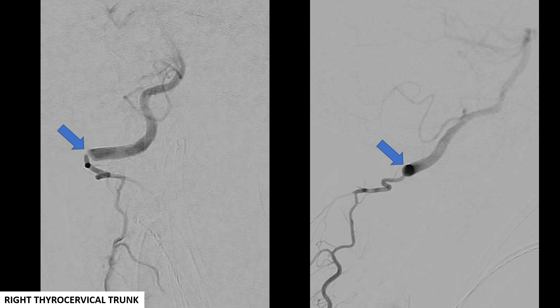Injection of the right thyrocervical trunk demonstrated significant collateral filling of the intracranial right vertebral artery.